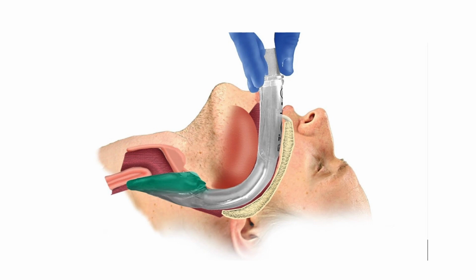One of the more common issues with supraglottic placement is the temptation, if it's not working right or if it doesn't feel like it's seated right, to push it in a little bit farther. And actually, one of the better ways to troubleshoot these is try pulling it back first, and usually that helps. Usually the error is that it's in too far. And if you're having an issue, try pulling it back. I know it's counterintuitive, but sometimes that will help as you're trying to measure your ventilations and make sure that they're adequate.